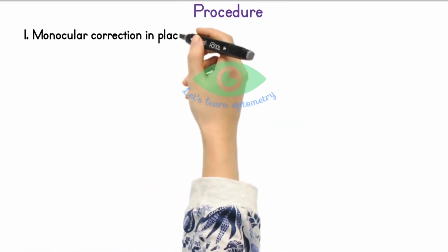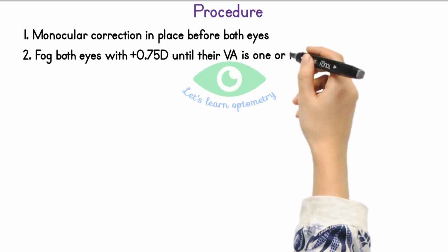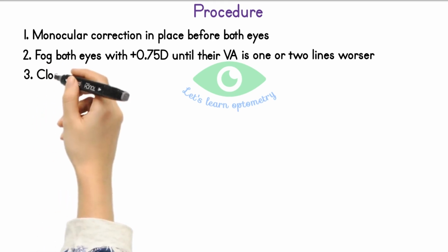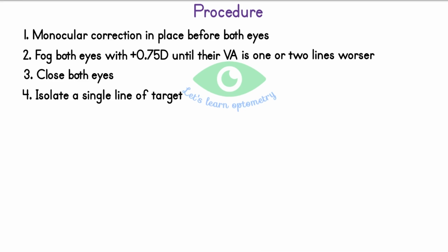Procedure. Begin the procedure with the monocular correction in the trial frame before both eyes. Test distance is at 6 meters under normal room illumination. Fog each eye with plus 0.75 diopter spherical until the visual acuity is 1 or 2 lines worse than the BCVA before fogging. If the acuity is not worse enough, add additional 0.5 diopter. If the fogging is sufficient, ask the patient to close both eyes. Isolate single line of target, that is 1 or 2 lines worse than the initial BCVA.